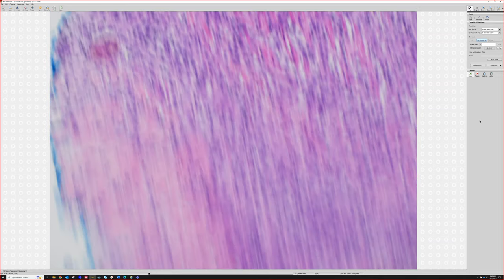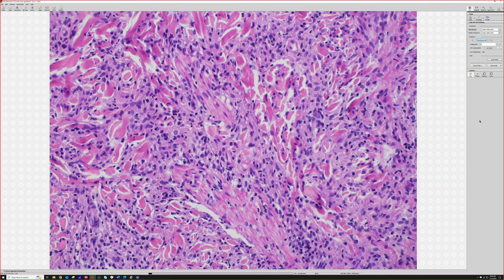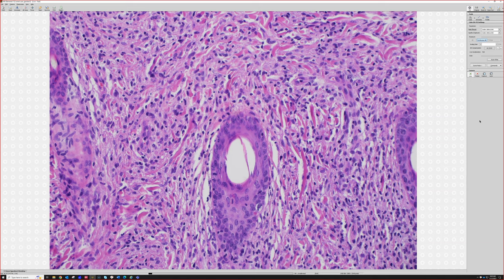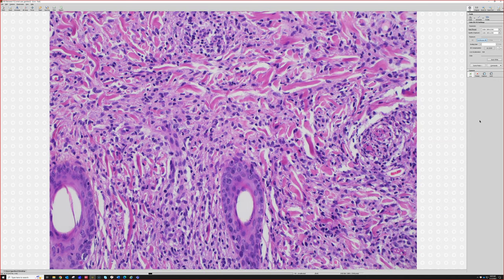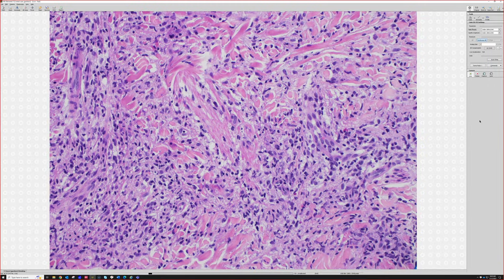What could we be thinking of? Granuloma faciale. Yes, that's one thought. The one thing we're missing for granuloma faciale is neutrophils. I feel like almost always when I see granuloma faciale, we have neutrophils. There will be some histiocytes too, but I feel like we get more neutrophils and lymphs, not quite so many histiocytes. But I like that you thought of that because it fills the dermis just like granuloma faciale does. That's a great idea. But usually they'll be like this with scattered little neutrophils all over the place, which is a very unusual pattern of inflammation, I feel. So that's a great thought.